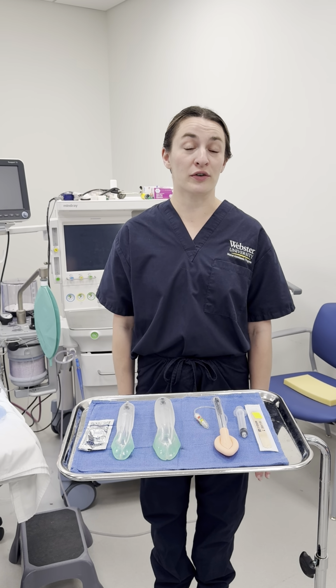So now that we've discussed when you shouldn't use them, when you should use them, one of the benefits is that the patient can breathe spontaneously the entire time while they're in place. You would also use these when you were having trouble masking a patient and you needed to oxygenate and ventilate them. You can use them as your primary airway management for anesthesia. And you can also use them as a conduit for endotracheal tube placement, okay?